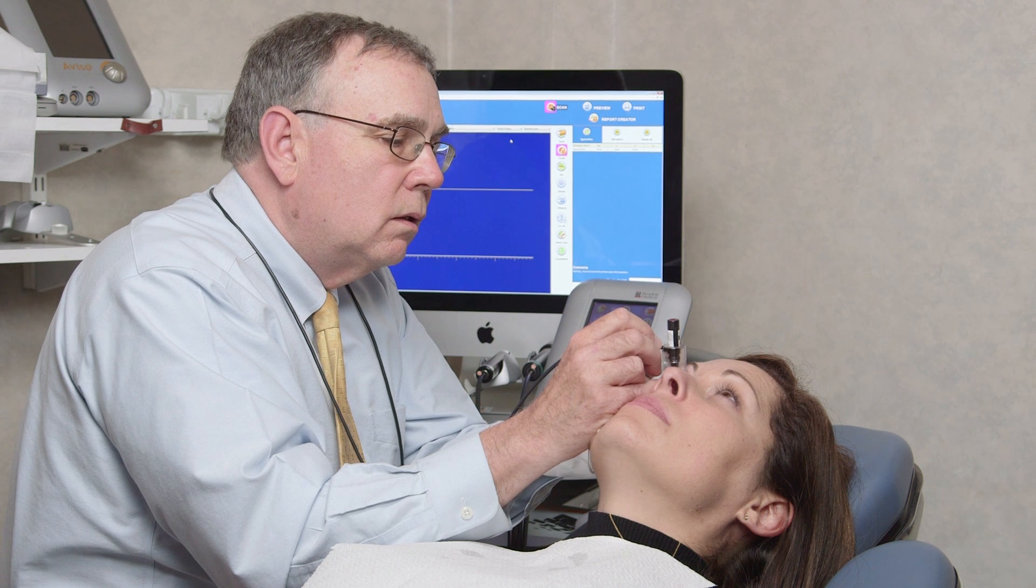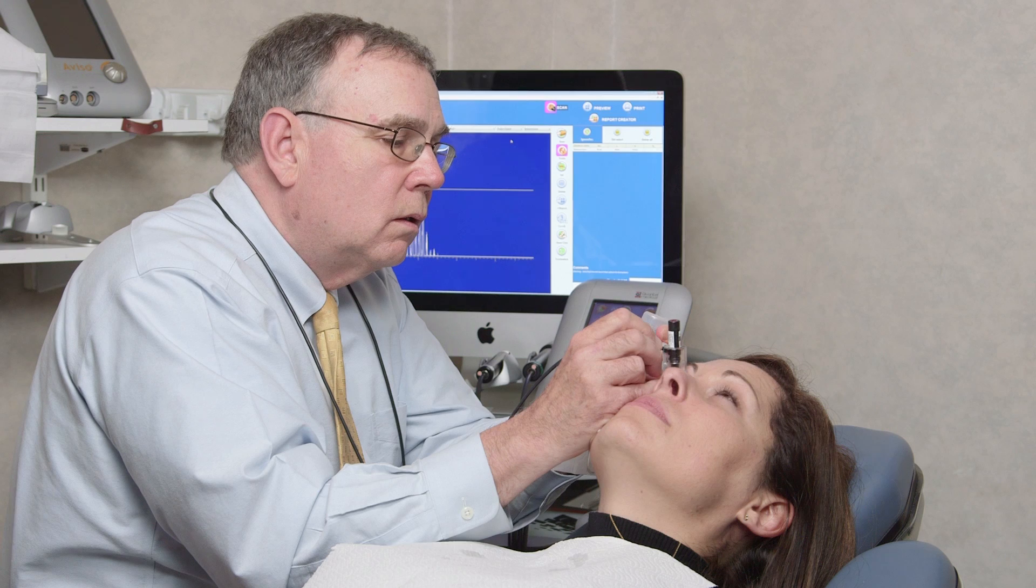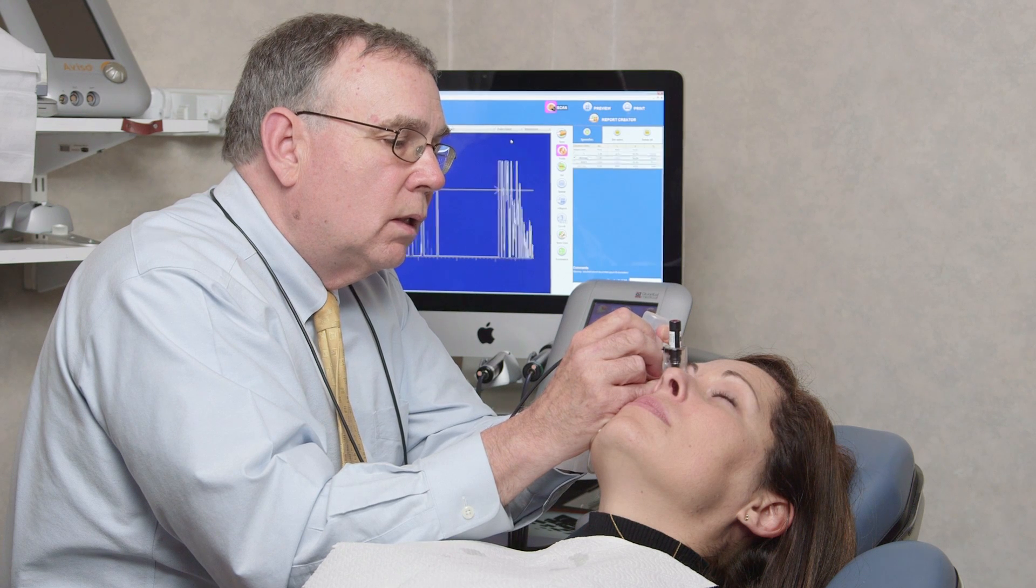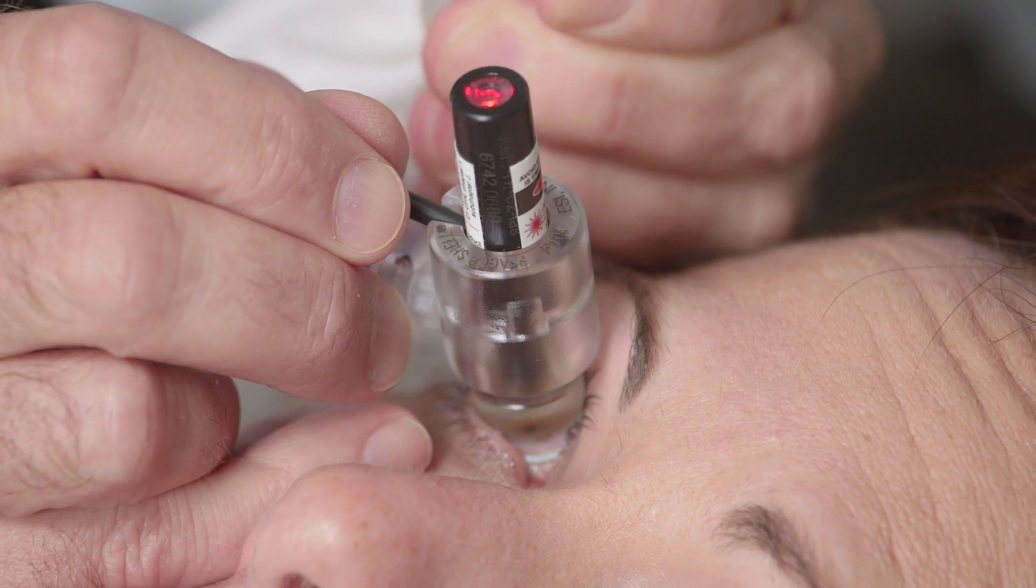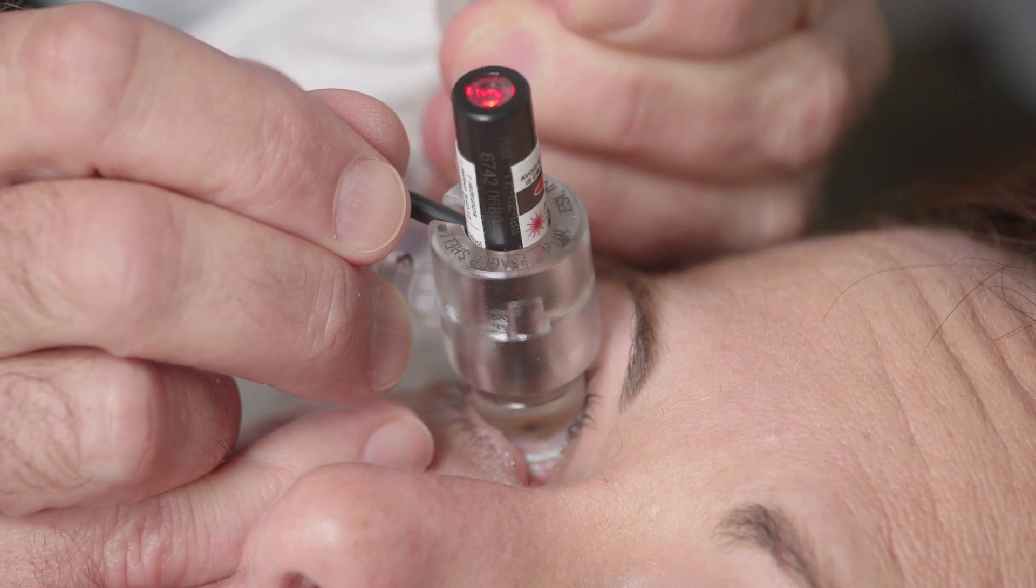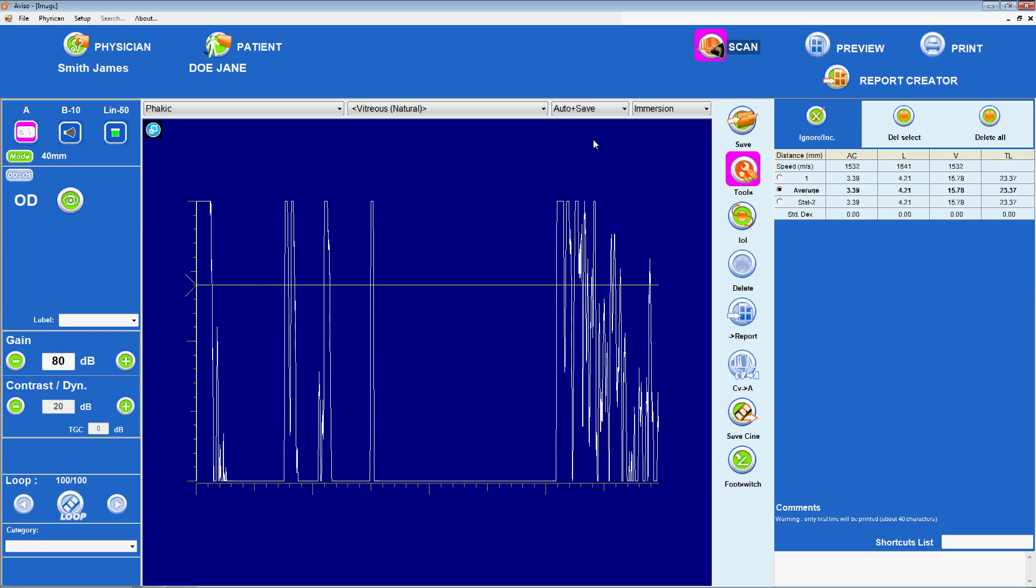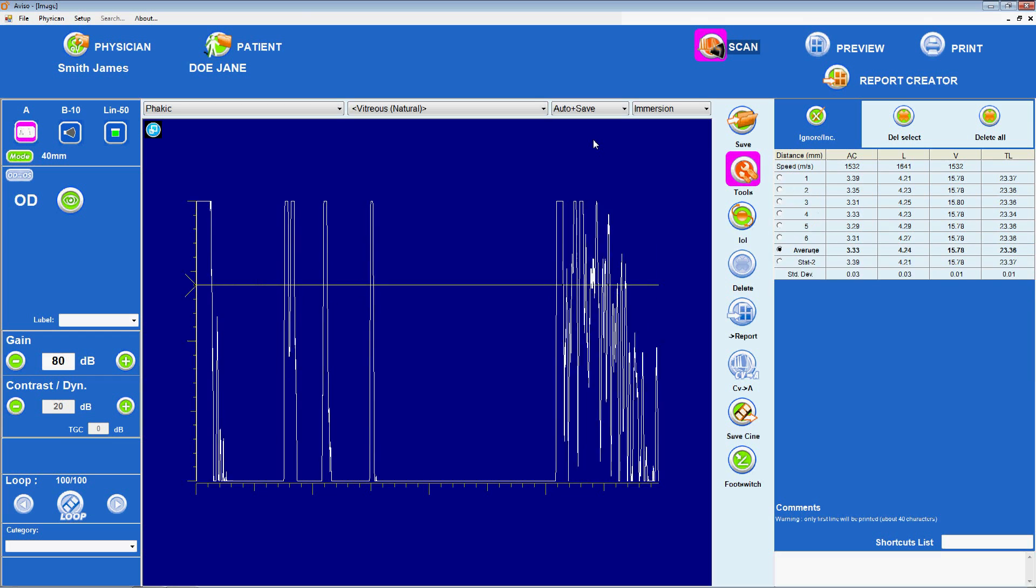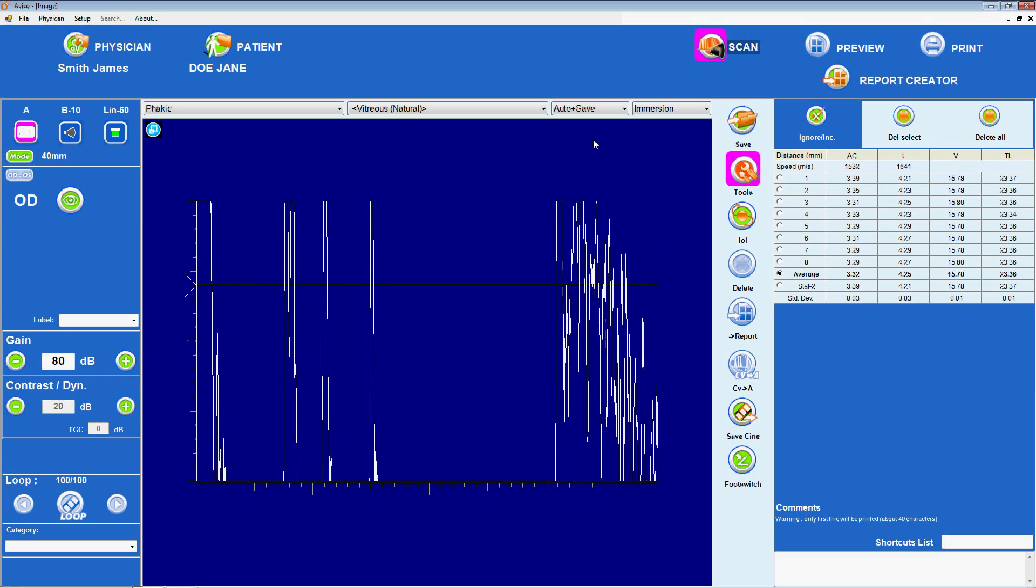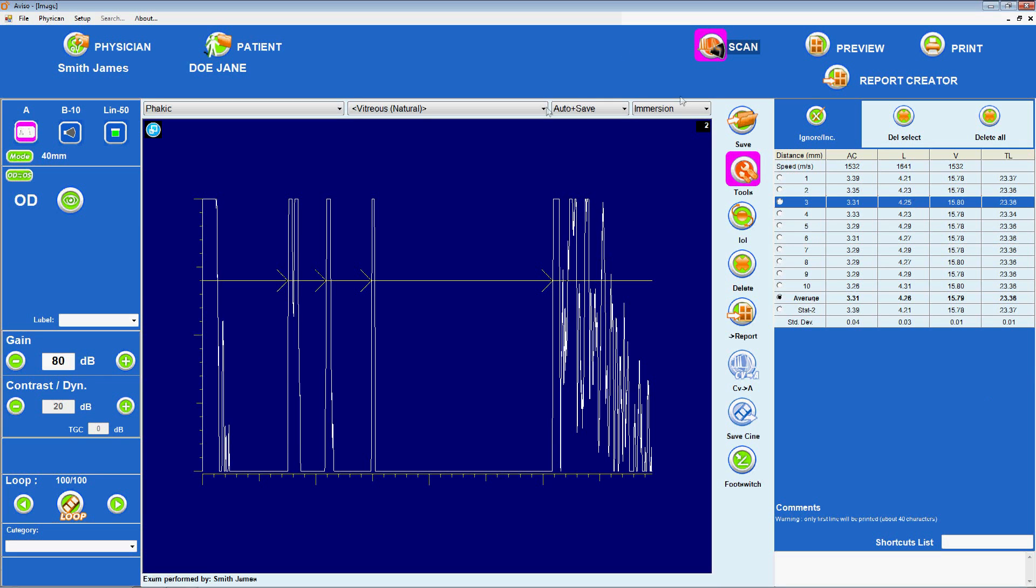Now, perform a series of scans. A maximum of 10 may be obtained within a period of about 30 seconds in automatic mode. Remember that the machine is recognizing high signals, so it is vital to evaluate each scan obtained to confirm that the appropriate spikes have been measured. At least three measurements are needed for the IOL power calculation, and more may be used depending on the protocols of individual clinics.